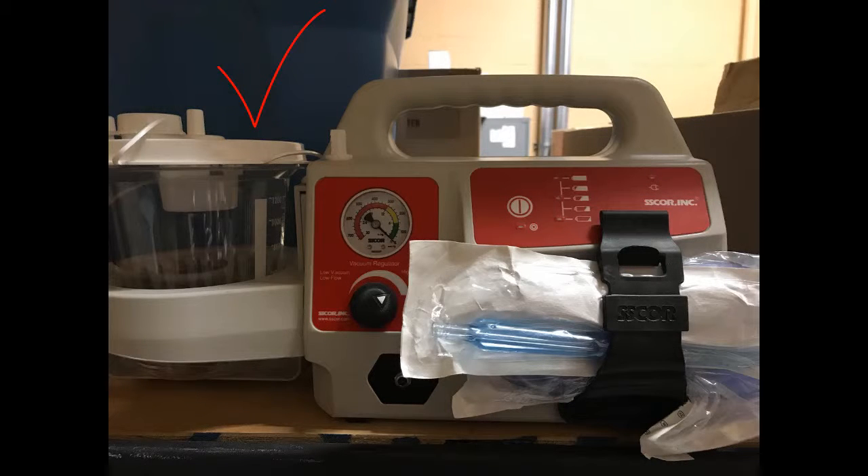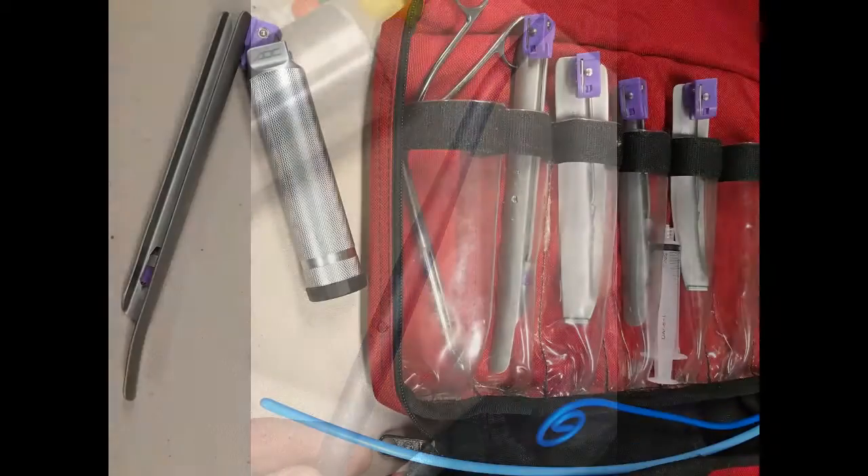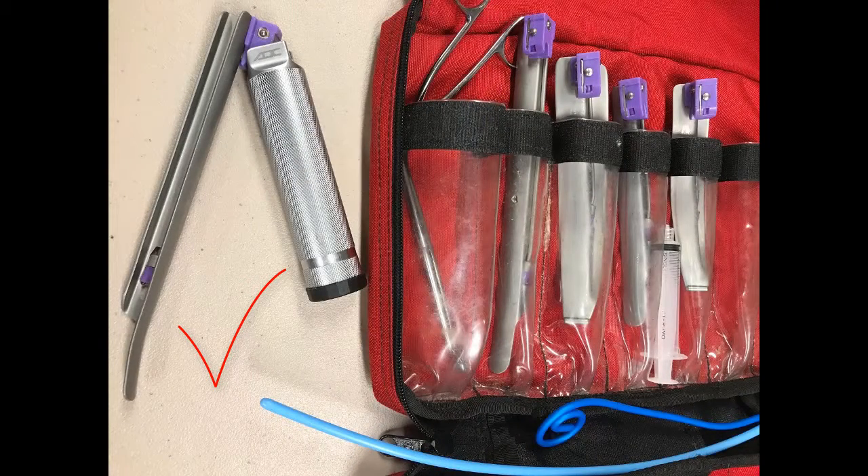Obviously, we're going to need our suction unit. Make sure your battery is charged and your stuff is there with it. You're going to need the rigid suction catheter, and pay special attention to this hole here. Ducanto catheters don't have this hole, but many of the ones on the market do. Other catheters have this hole, and it has to be covered in order to maintain suction. You'll need your other hands, so you're going to have to cover that with a piece of tape or something to keep your suction running when you go into the hands-free mode with this technique. You also need your laryngoscope and your airway kit.